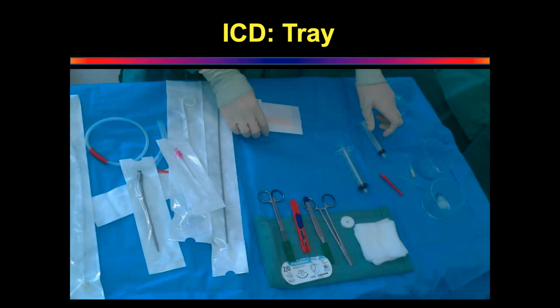Once we have done that, then we make sure. Tell me how the pigtail will go on the guide wire. Sir, you have to loosen the thread, which is keeping the pigtail taut, in order to make it straight. Okay. And once you guide it over onto the guide wire, then you have to hold the guide wire straight and then push the pigtail catheter in.